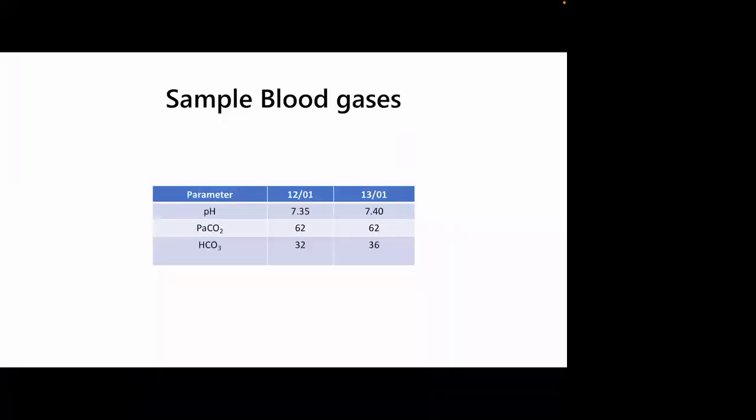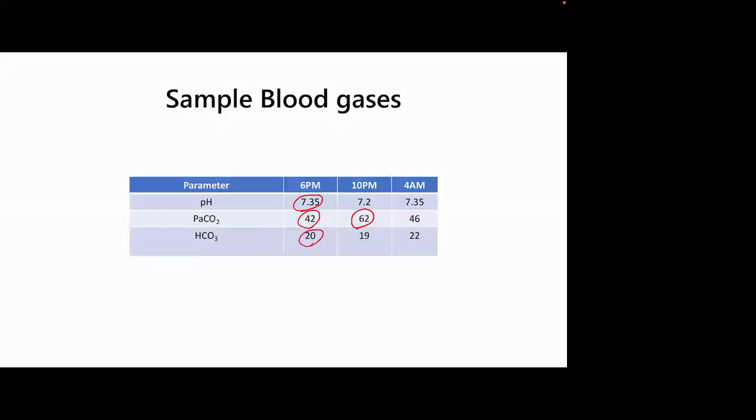And that is mostly because of a tube block or a developing pneumothorax. With tube block, there was respiratory acidosis, and it got corrected with proper suctioning. So the blood gas became normalized, and the bicarbonate levels also improved.